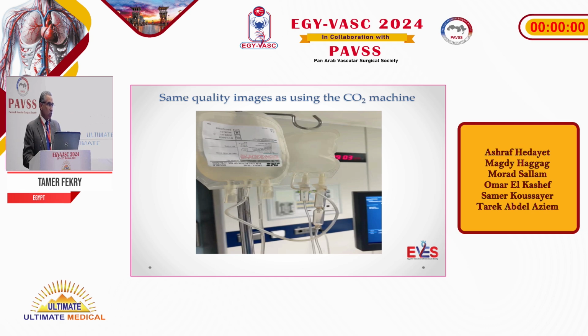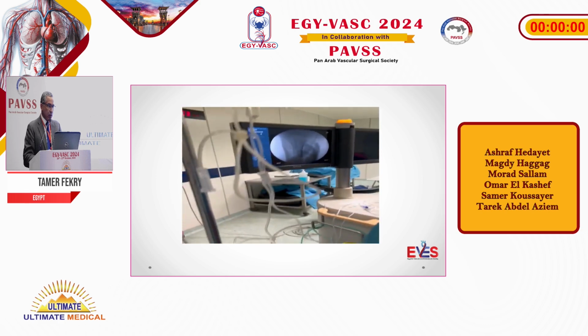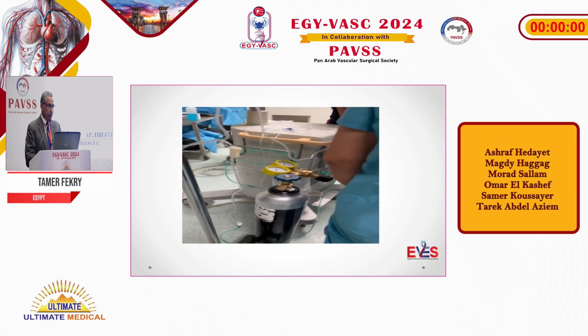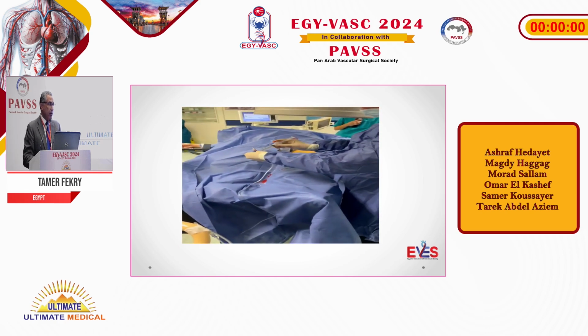And this is not actually a new technique. And here is a video illustrating this connection. And the quality is nearly the same as the machine used for injection of CO2.